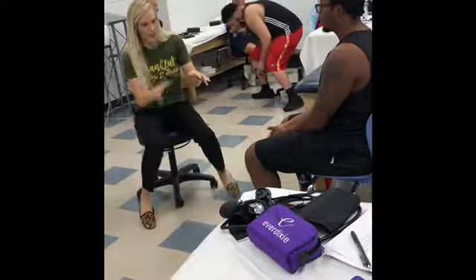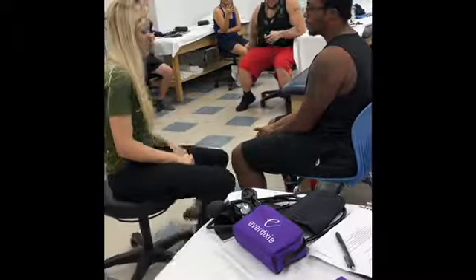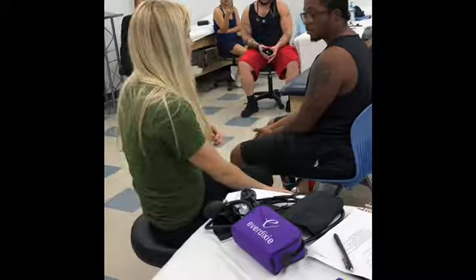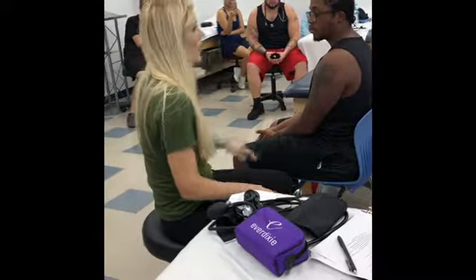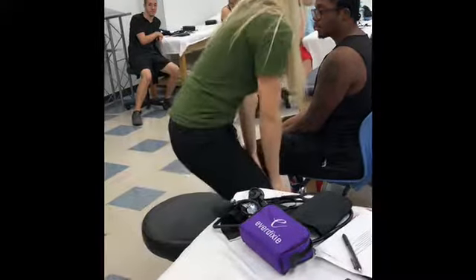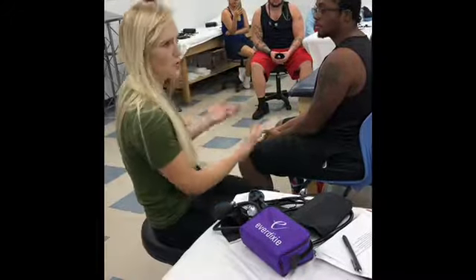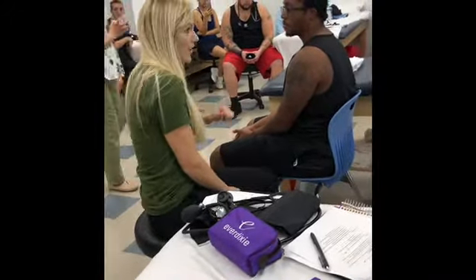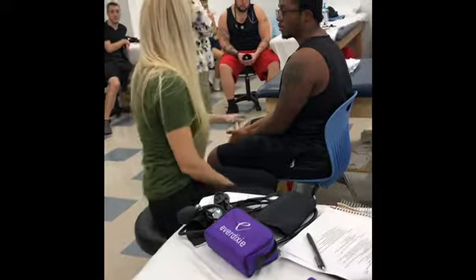Alright, so I'm going to be in close quarters here so we can take some of these vitals. You just get to sit here and relax, okay? So first I'm doing respiratory rate. I'm going to let Dr. Reed, my evaluator, know that we're doing respiratory rate. Obviously, Q knows that we're doing respiratory rate as well, but I'm going to tell him that we're not doing respiratory rate. So I'm going to tell him I'm going to check your pulse.